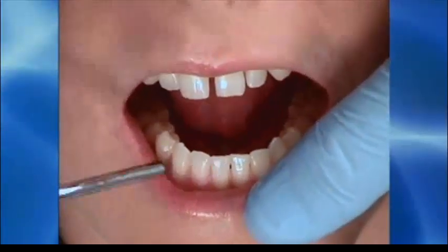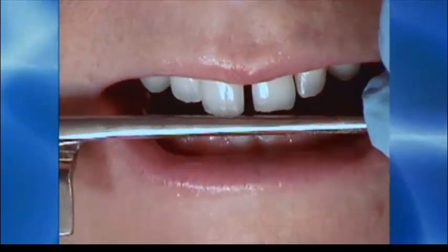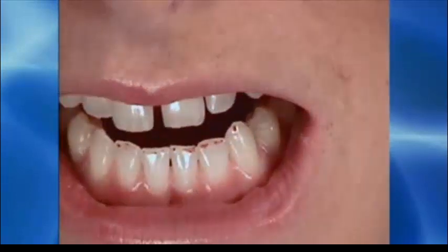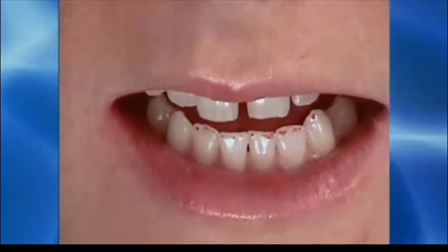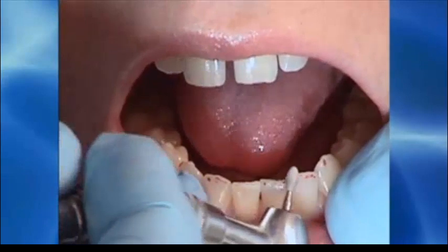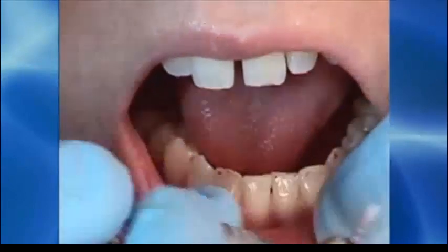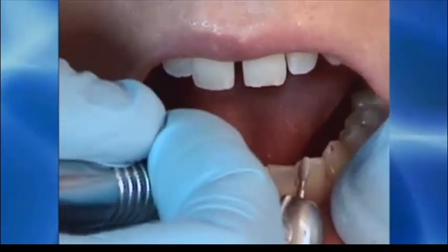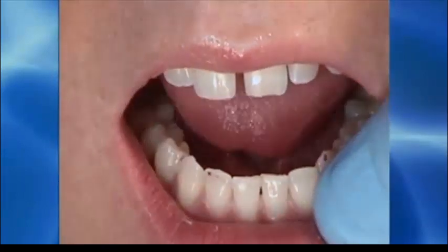So I will dry the teeth again, but this time have the patient self-intercuspate without sliding in any direction in order to mark the lower anterior teeth and the upper anterior teeth where there is too much anterior pressure. The contacts that create the pressure are generally down on the facial aspect of the incisal edge, and you can see all the series of marks that make up this excessive anterior pressure. Here I'm going to plane back the incisal edge, not shorten the tooth, but cant the facial aspect of the incisal edge towards the incisal lingual so that there is still contact but less surface engagement of the lower anterior teeth against the back of the upper anterior teeth.